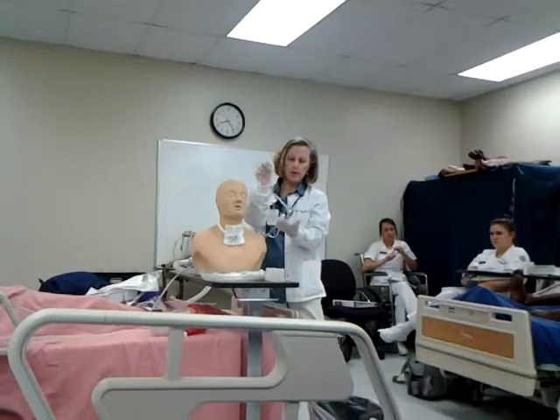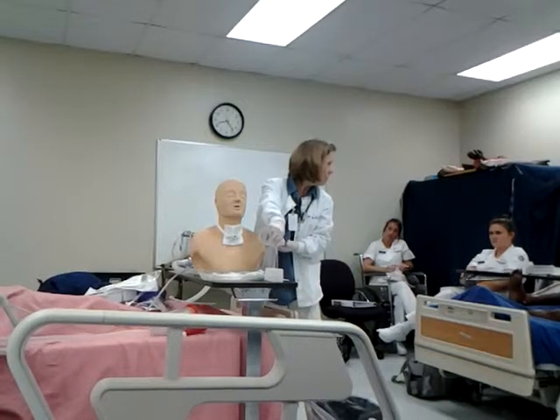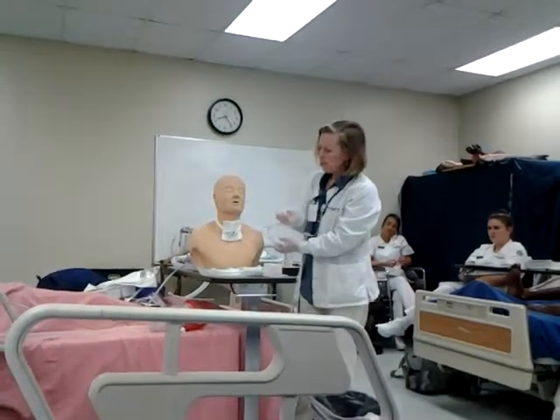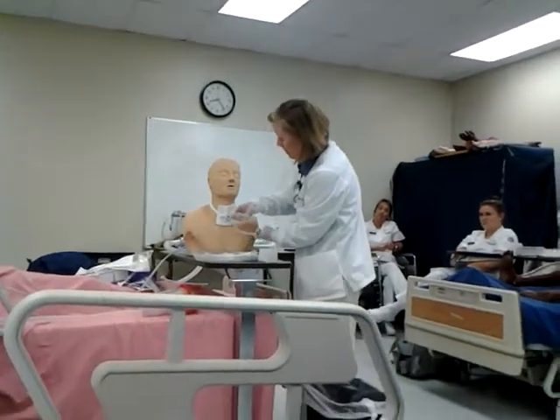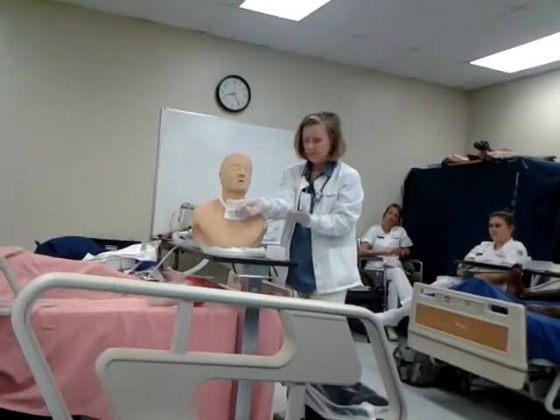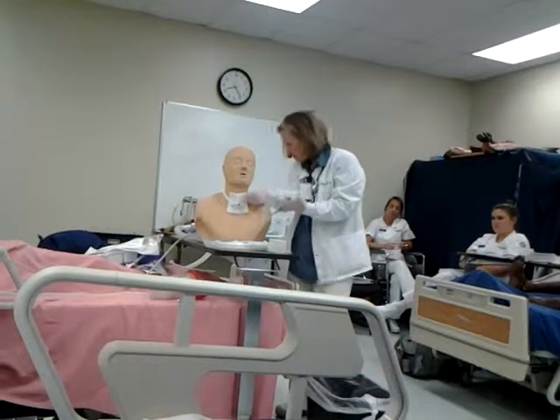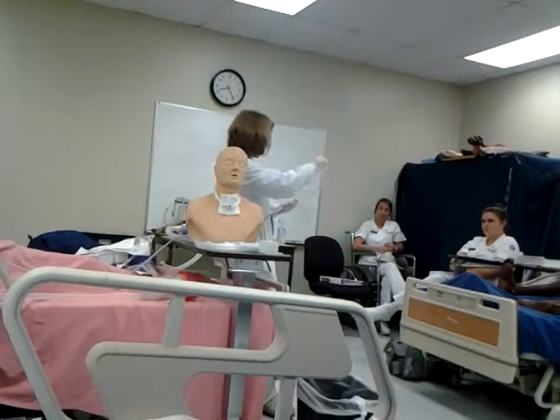And so then I'm going to occlude my port and suction up some of my saline to lubricate the tube. Then I'm going to go down into the trach. I'm not applying any suction. Once I get down, I'm going to alternately see this? And I'm going to rotate my catheter tip. Okay? That's one pass. As I'm pulling it out, you're going to go like this.